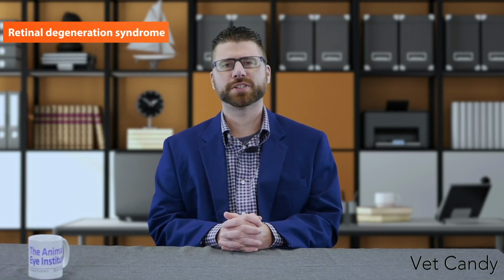In this picture is diffuse retinal detachment, and you can see the retina billowing forward in this eye. And in this picture, there is peripapillary fluid consistent with optic neuritis. So let's talk about some specific diseases. We'll start with sudden acquired retinal degeneration syndrome.